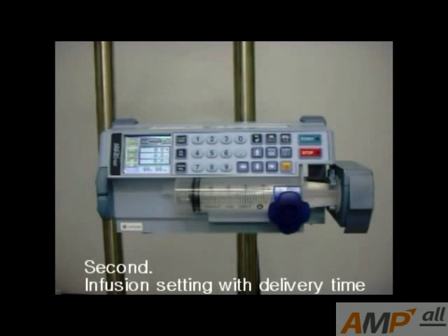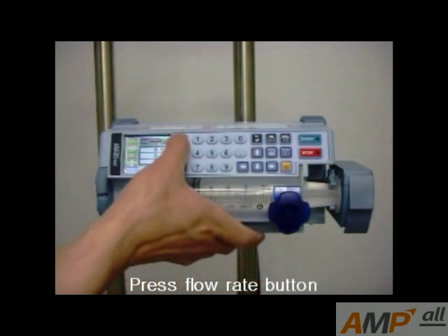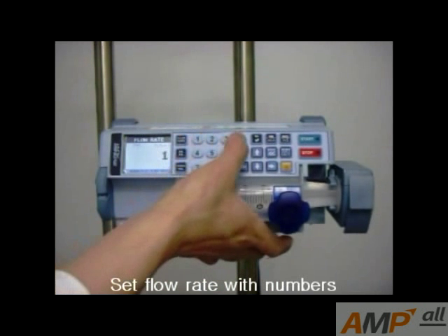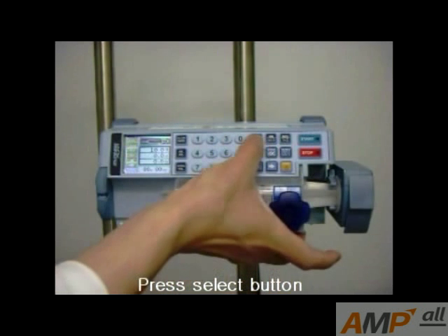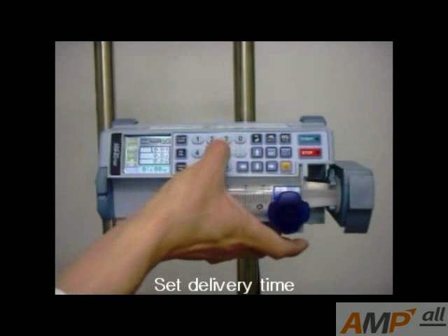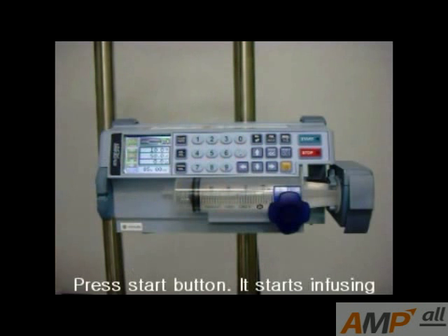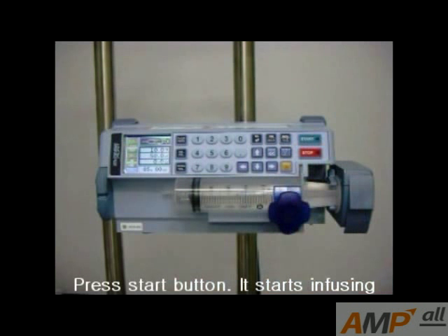Second, infusion setting with delivery time. Press the flow rate button and set the flow rate with a number. Press the select button and set the delivery time. Total delivery volume is automatically calculated. Press the start button — it starts infusing.